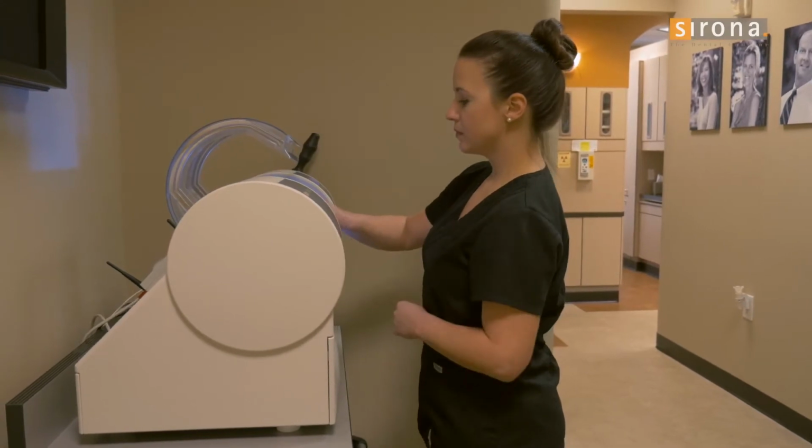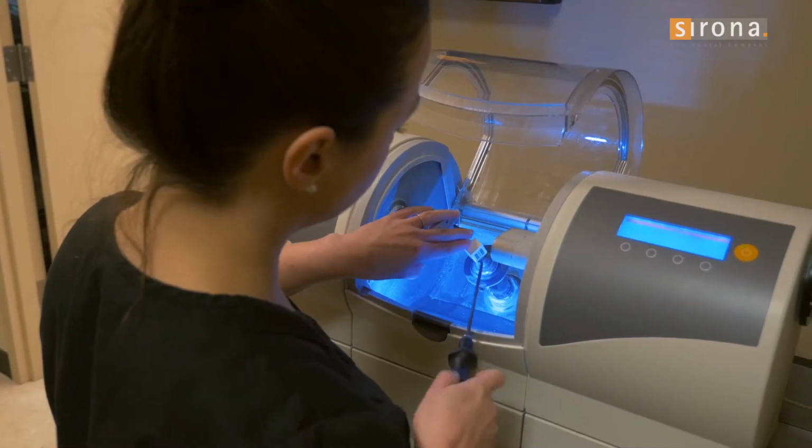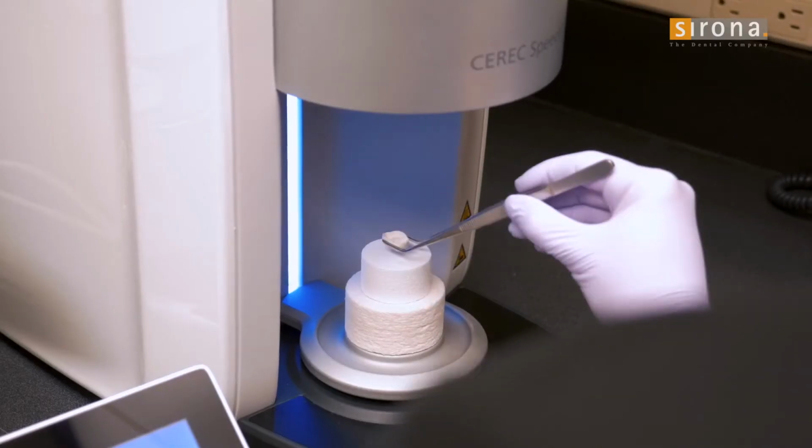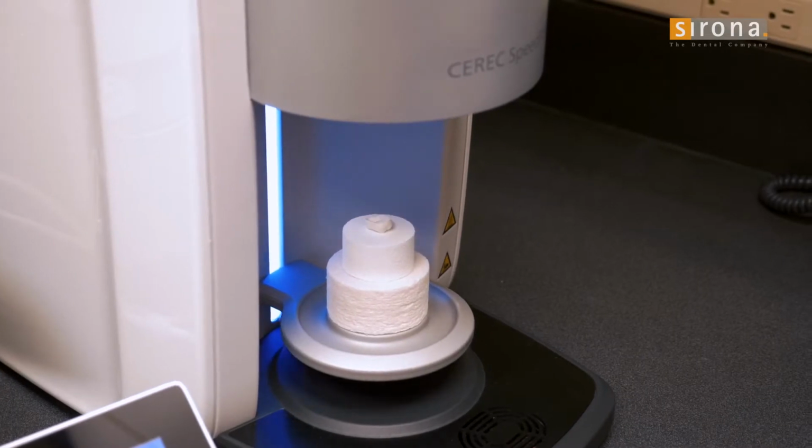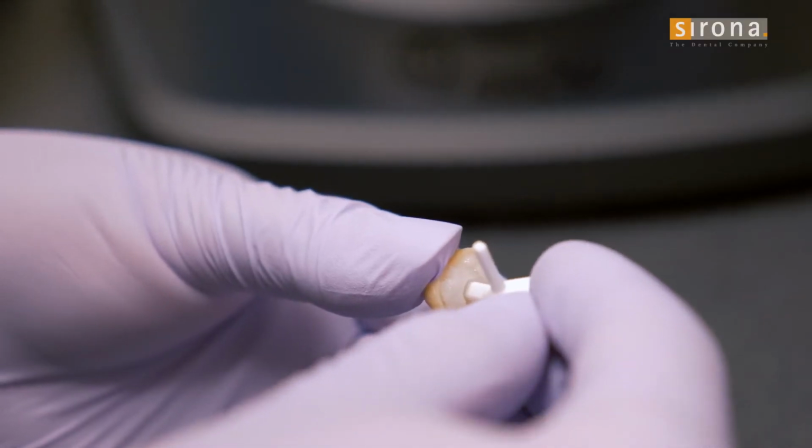And in this case, we're going to have a zirconia crown milled out of this block and then run it up in the oven so that it reaches its final strength. And again, this is a big part of the single visit story, is that the patient's not having to come back for this second appointment. We're making the permanent crown on this same day.